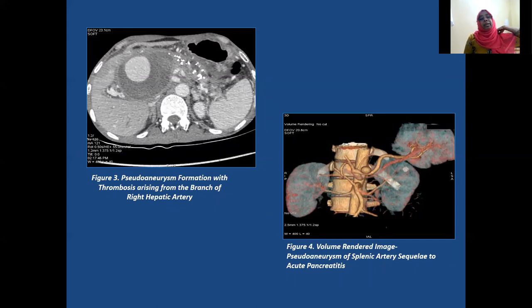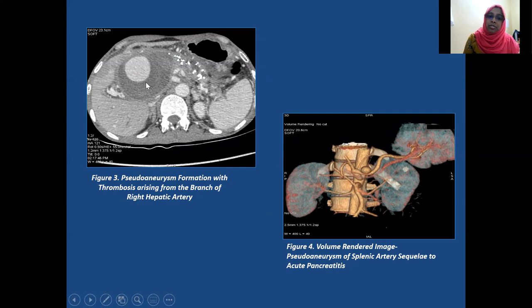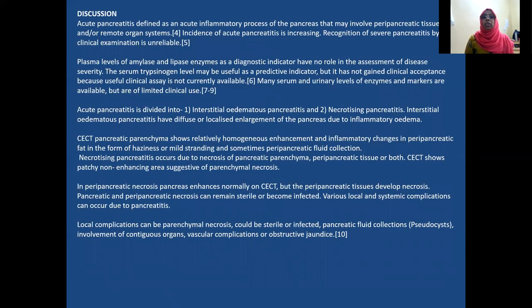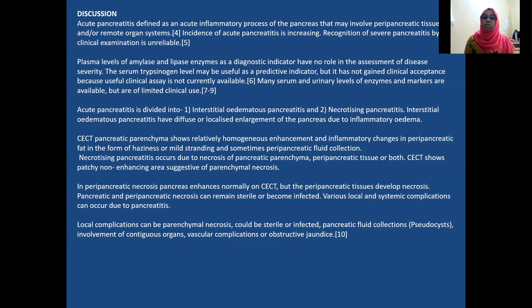Due to the proteolytic effects of pancreatic enzymes on various vascular structures, erosion and pseudoaneurysm formation can occur. We noted a pseudoaneurysm arising from a branch of the right hepatic artery, and we can also appreciate pseudoaneurysm formation of the splenic artery. Acute pancreatitis is defined as the acute inflammatory process of the pancreas that may involve peripancreatic tissues and remote organ systems. It is divided into acute edematous pancreatitis — diffuse or localized enlargement due to inflammatory edema — and necrotizing pancreatitis, which occurs due to necrosis of pancreatic parenchyma, peripancreatic tissue, or both. Contrast-enhanced CT shows patchy non-enhancing areas due to pancreatic necrosis.